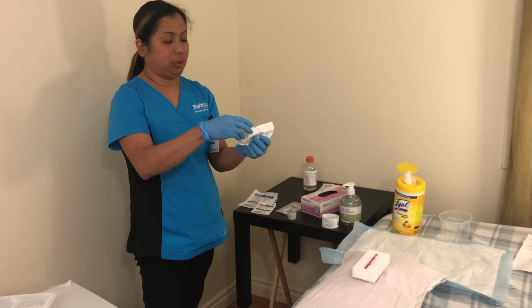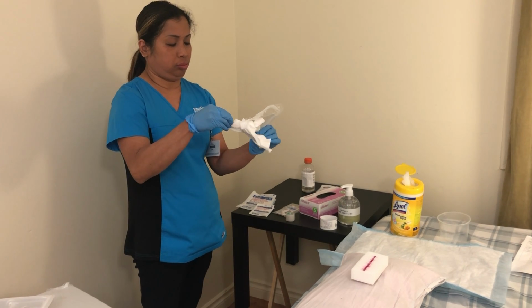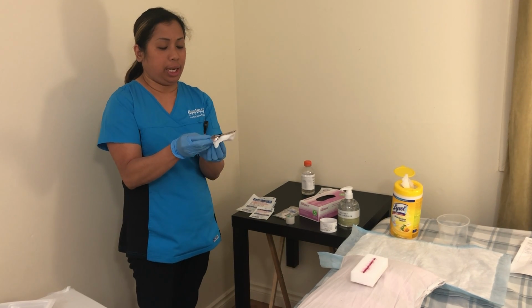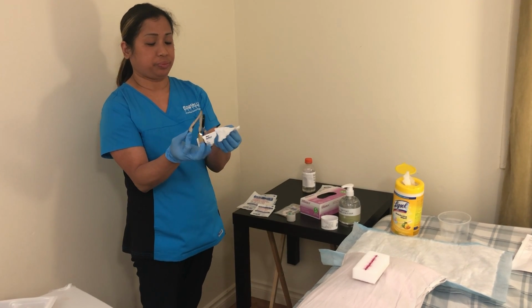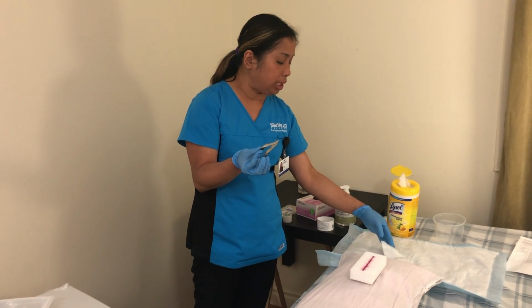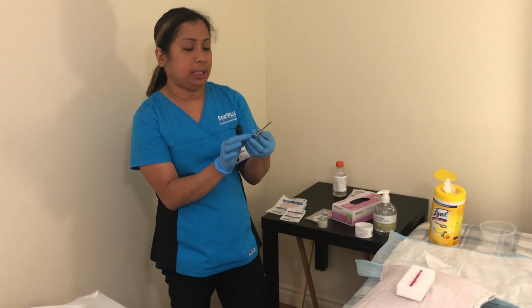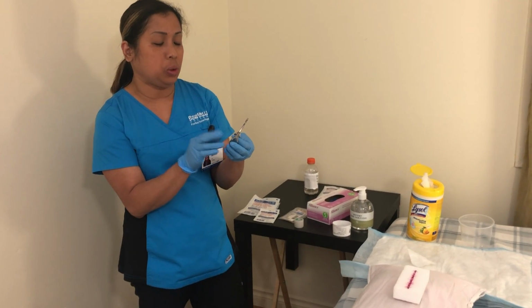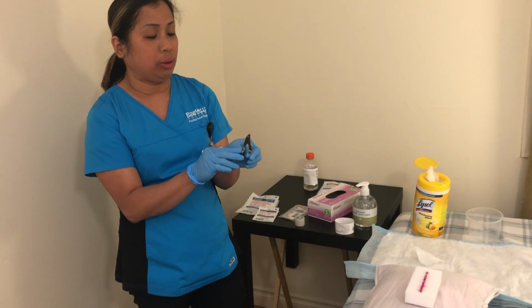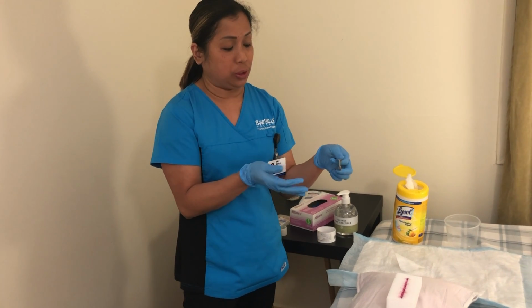So I will grab this one. Okay, I'll just put it here because I'm going to use it when I remove the staples. Now, this staple remover has two teeth on one side and one tooth on the other. The two teeth should go under the staples.